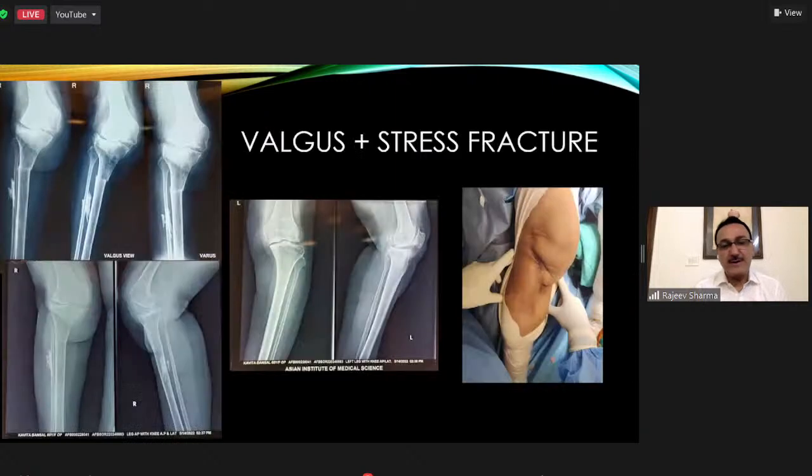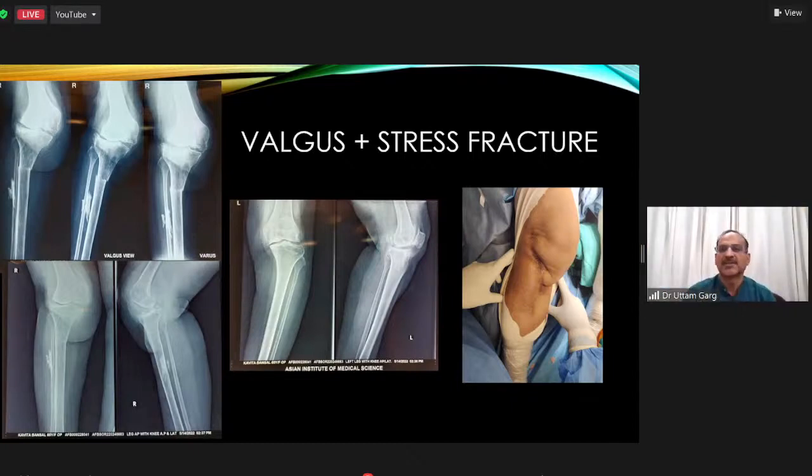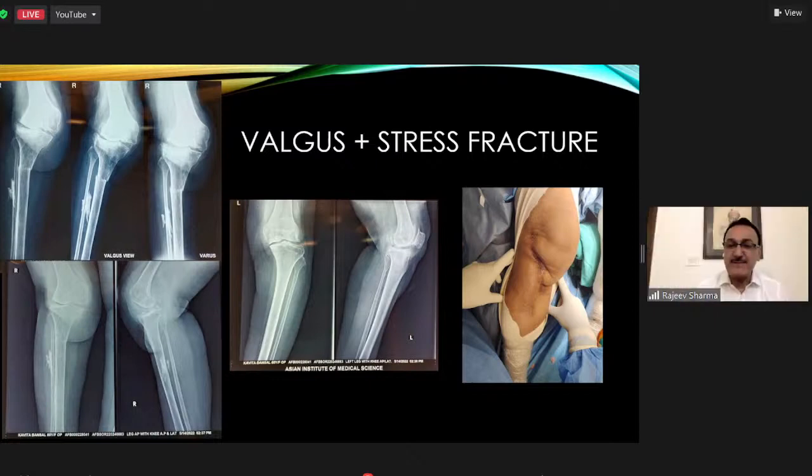Yeah. Can we go back to the, yes. That's right. So in the presence of the lateral surgical scar, previous surgical scar, can we ask the faculty what is the approach that they will prefer? Manoj, would you still take up the medial parapatellar approach in this case, or you'll prefer a lateral approach? I think he has left. Manoj, Dhan Shekhar, what would be your preference?